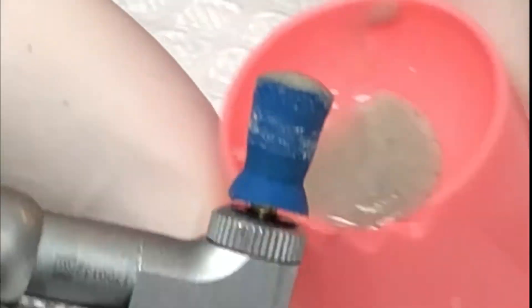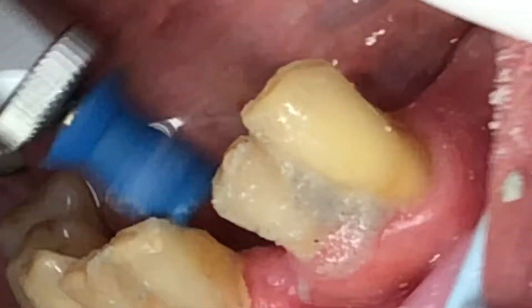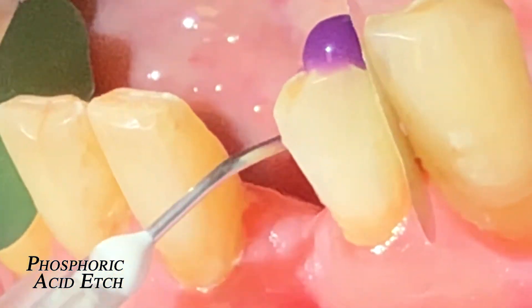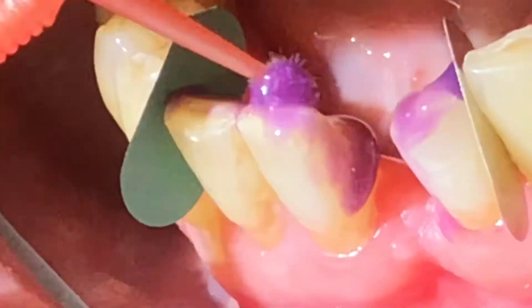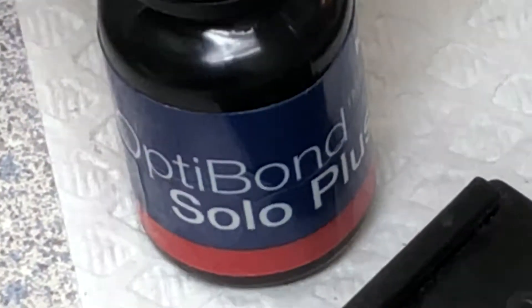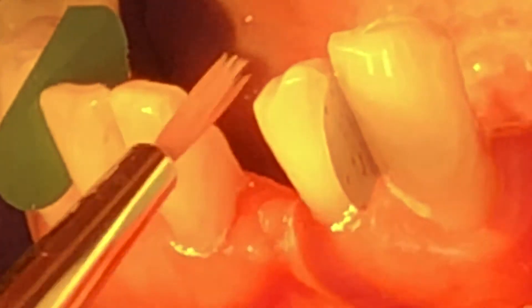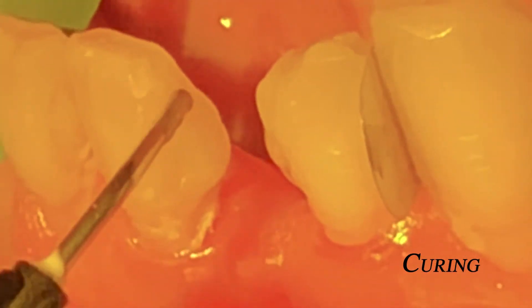Just suffice it to say that the procedure is technique sensitive. All the surfaces to be bonded have to be absolutely clean, and the dry field of operations has to be guaranteed. I usually use two fiberglass strips only to avoid excessive thickness on the lingual aspect. Attention has to be given in allowing access in the embrasures for oral hygiene under the pontic — namely, space for cleaning with a small proxabrush or a super floss.